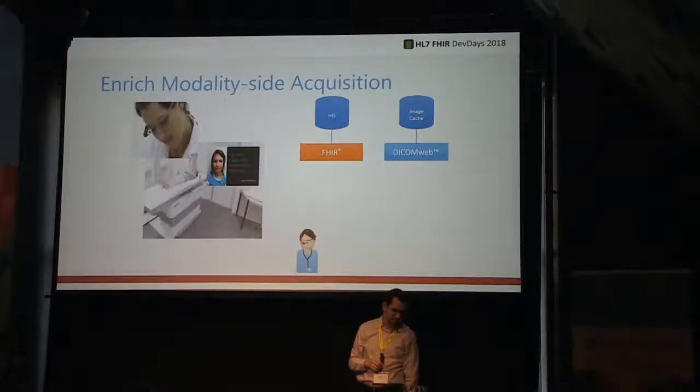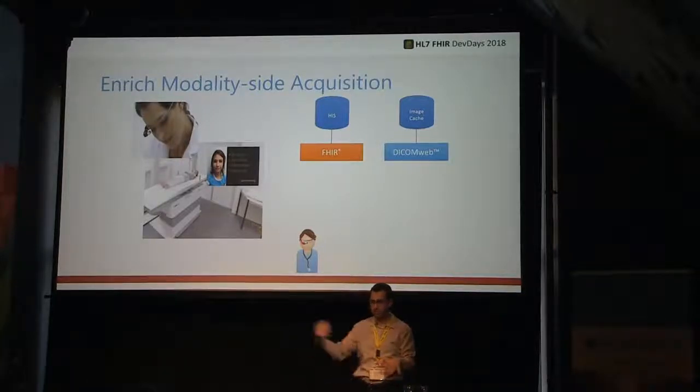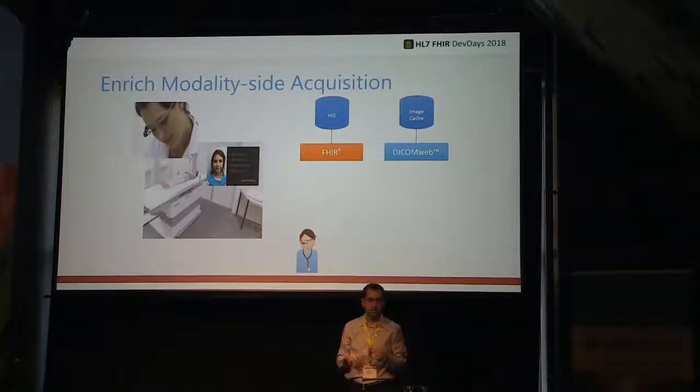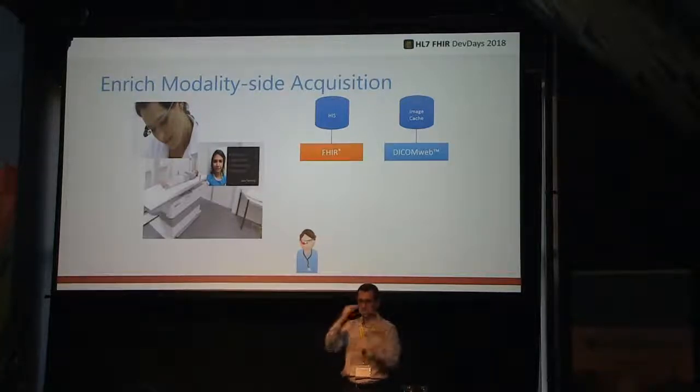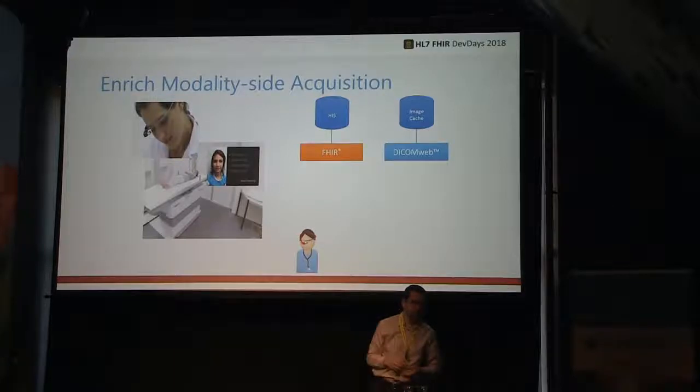Okay, here's another interesting use case. This one is a little futuristic, so use your imagination here, but don't think too much about the Google Glass part of it. Think about your actual technologist in a hospital, the person who's running that X-ray room. In front of them, they have their work list. In this case, this is a DICOM-driven workflow because that's what the capture usually is. But imagine if you're able to connect their work list with FHIR to bring in additional information, something as simple as the patient's picture. So when they go to the waiting room, they know who they're looking for. That's one thing. You could bring in things like allergies, known symptoms, etc. Or a little bit of patient history.